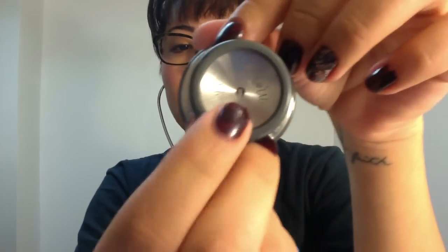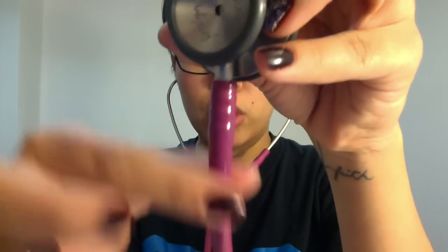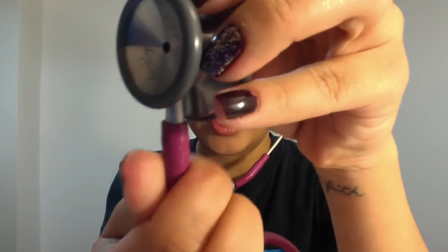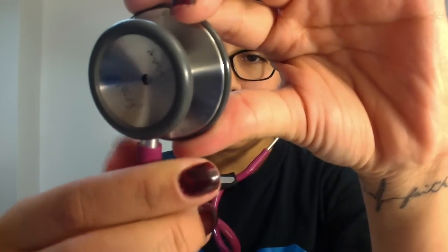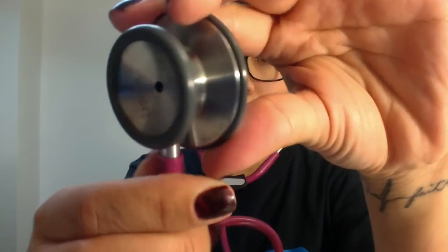Make sure your bell is always closed before you take a blood pressure. The way to open and close your bell is the tubing on your stethoscope — if you turn or twist it, it should open and close. On mine, I can turn it either right or left. I don't know about other stethoscopes because I've only owned this one for four years.